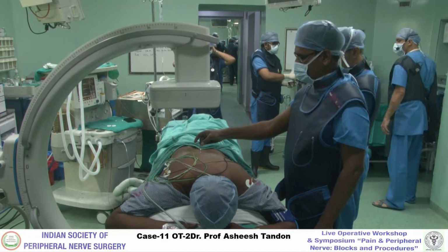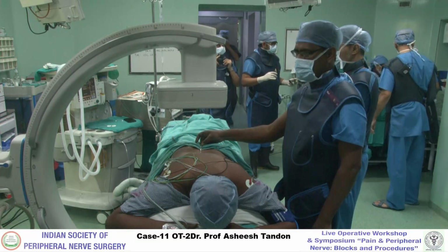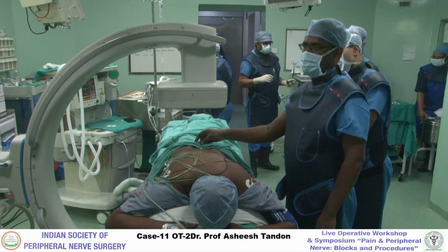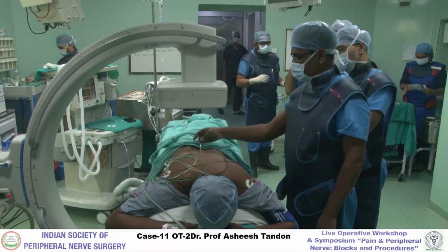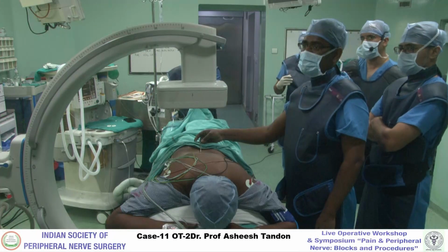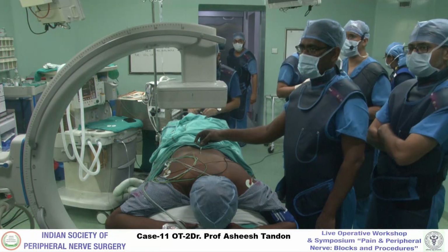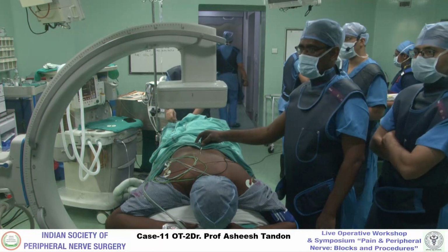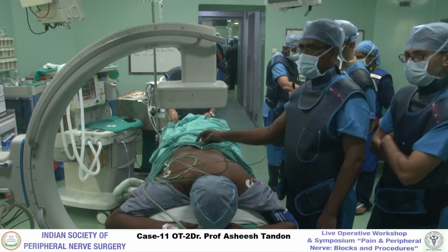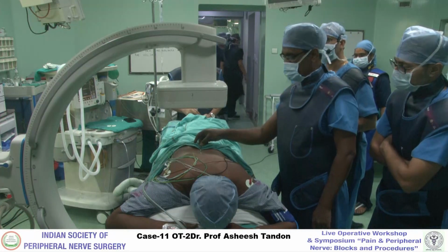So normally, Asheesh, for these patients, when you are doing in your OR setup there in Jabalpur, what is the monitoring you set up, and what is the number of people you require for this? People means technicians, nurses. So we'll require one anesthesia nurse, a C-arm technician and one scrub nurse. That's about it. And the standard monitoring, we'll have pulse, BP, ECG monitoring going on.